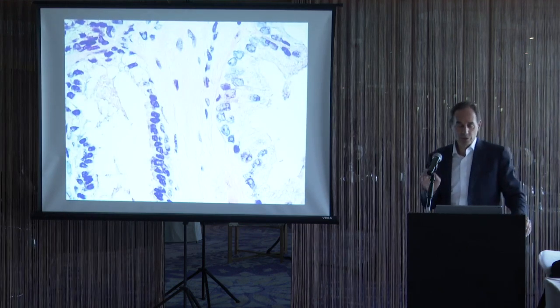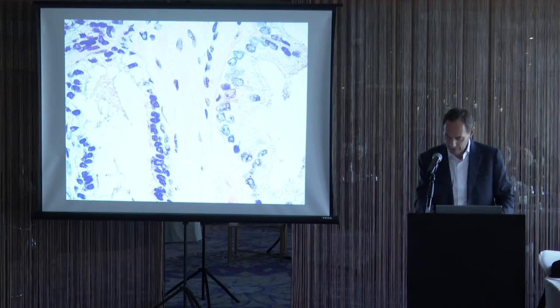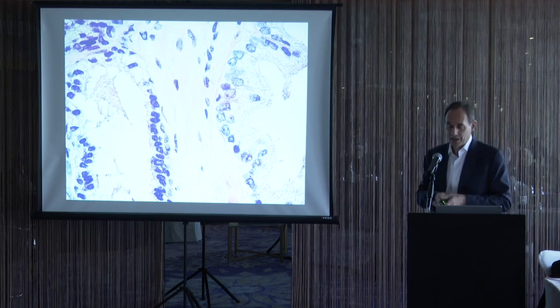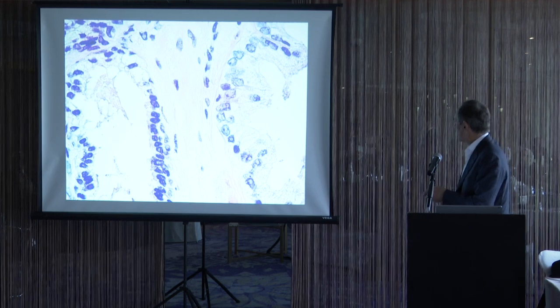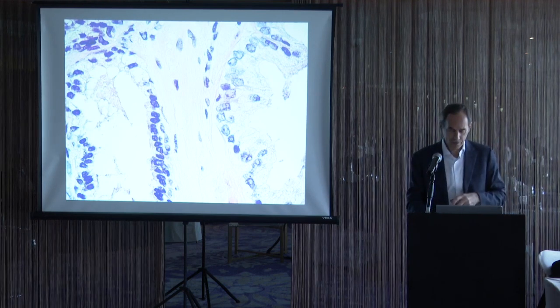What you then want to do is find, ideally, the glands that you know are benign. So if we look on the left, there are glands that we can recognize are benign. You then want to compare them to the glands that you're questioning, are they cancer? And look for as many differences as possible. And you can see here that many of these cancerous nuclei are much bigger than the benign nuclei. So nuclear enlargement is one of the features that we look for in cancer.